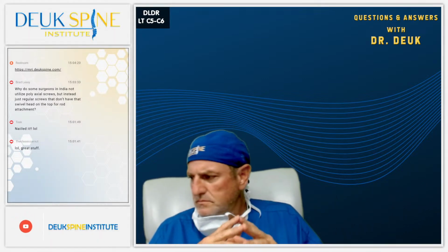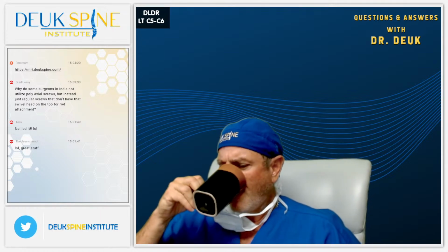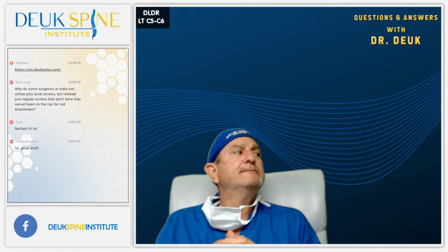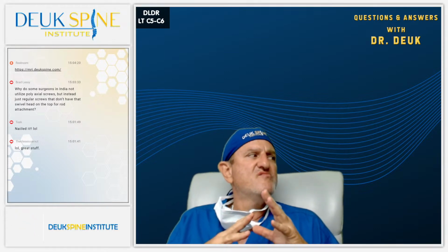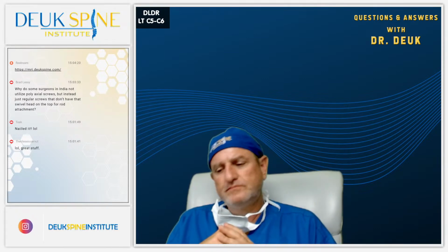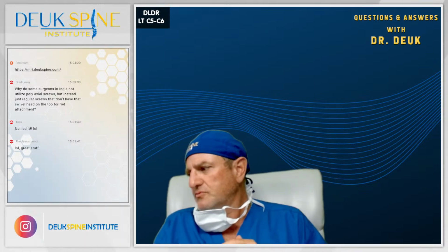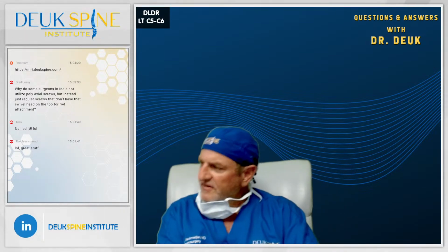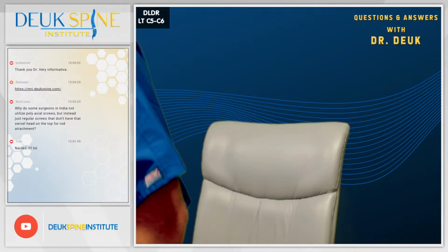Lastly, we have one more question coming from Brad on YouTube, asking, why do some surgeons in India not utilize polyaxial screws, but instead just regular screws that don't have that swivel head on the top for rod attachment? All right, great question. So, folks, what's being asked here is a really good question. I will try to see if I have a model I can show you.